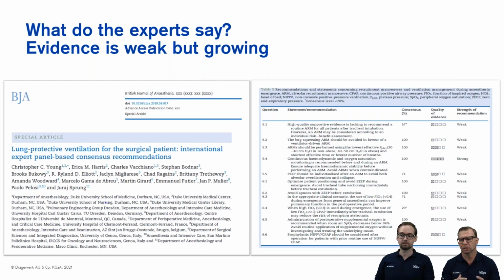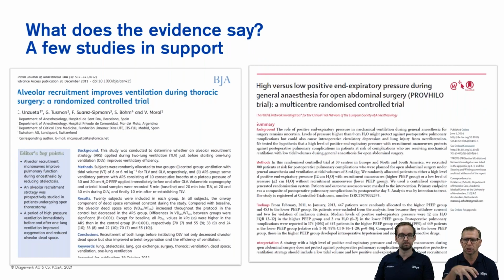And of course, that means these global experts are looking at ways to improve the strength and quality of the evidence. A lot of the evidence looks at short-term gains within the OR or the hospital. It doesn't really look at long-term morbidity and mortality, and there's not a lot of evidence yet that intraoperative recruitment manoeuvres reduce morbidity and mortality. But there are very clear links to a reduction in postoperative pulmonary complications, shortened time in recovery, shorter hospital stays, and potentially much less incidence of reintubation.